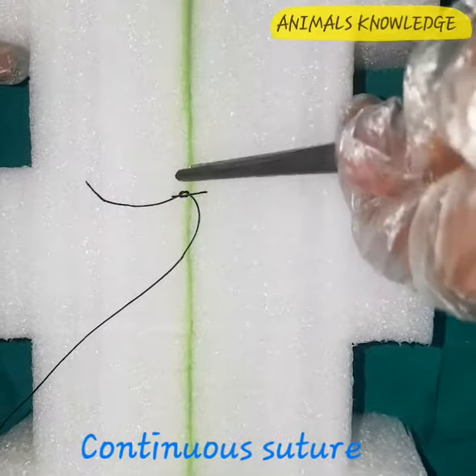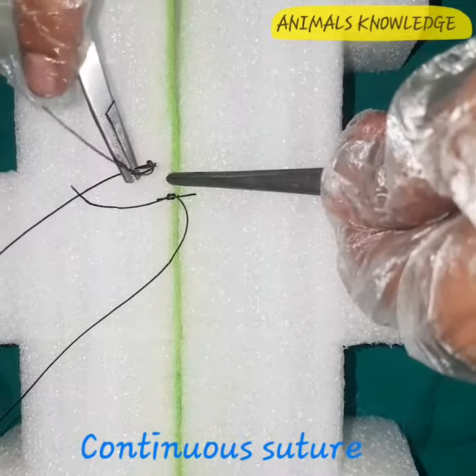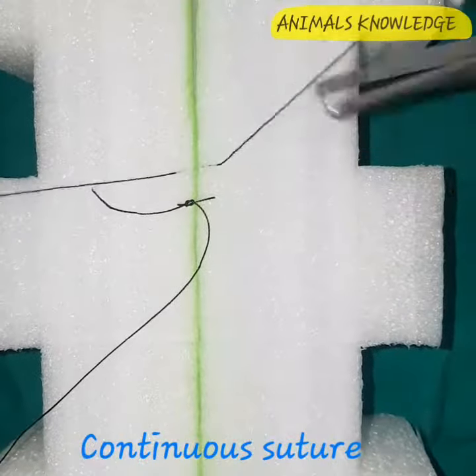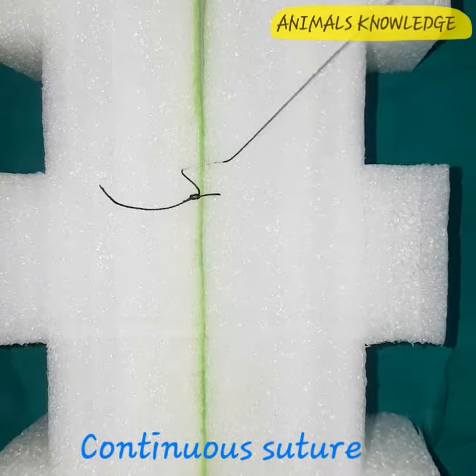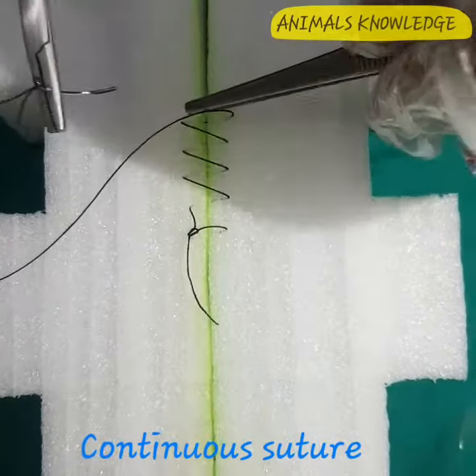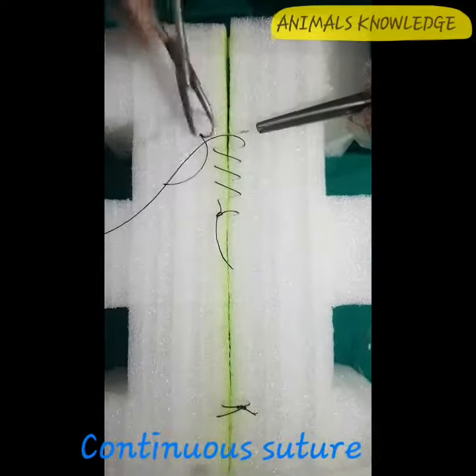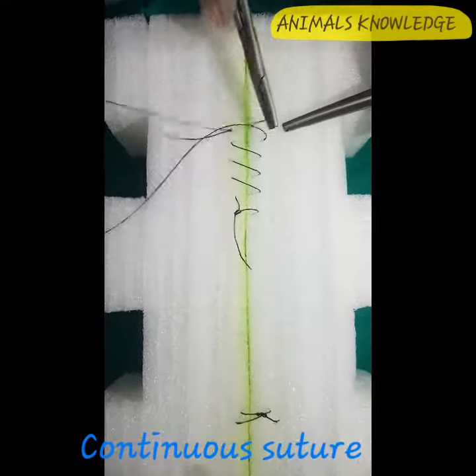Now continue the suture pattern. The distance between the two bites should be constant. Continue the suture pattern till the whole incision is covered. Now we have completed our continuous suture pattern.